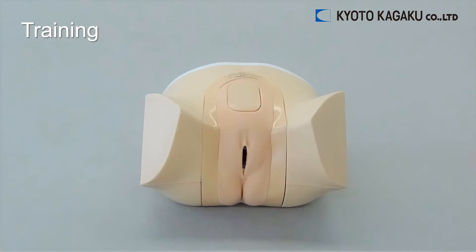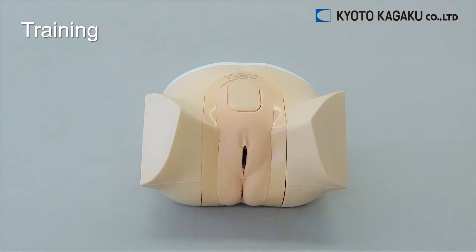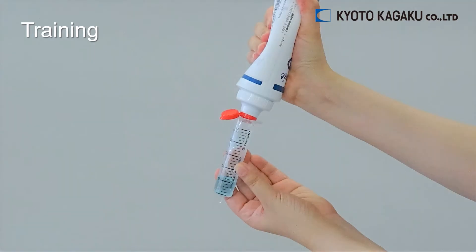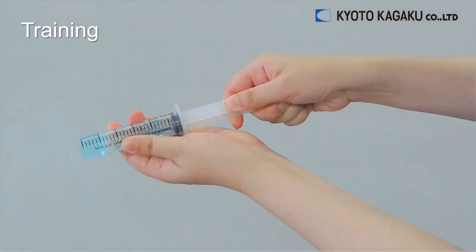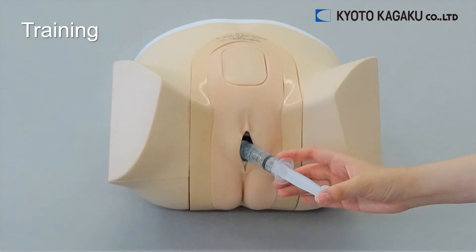There are two areas available for screening: transabdominal and transvaginal. When using a transvaginal probe, ultrasonic gel needs to be put on in advance. Use the gel with the syringe which comes with the set, and then insert it into the phantom.